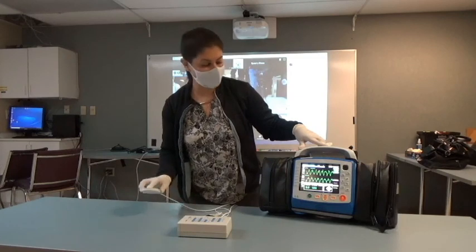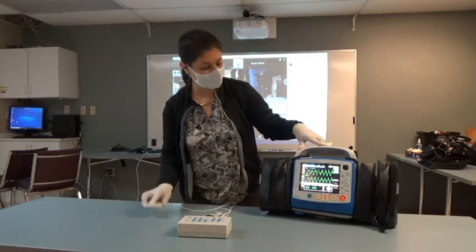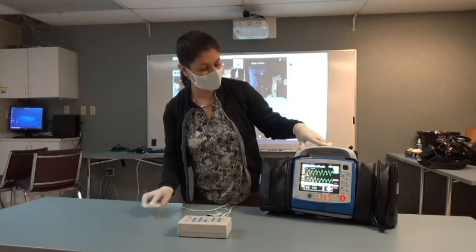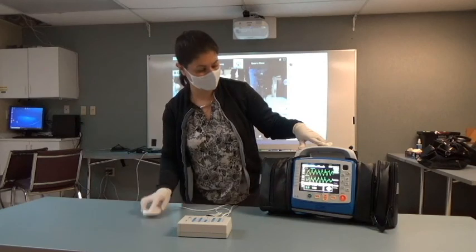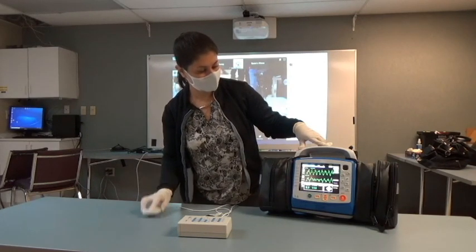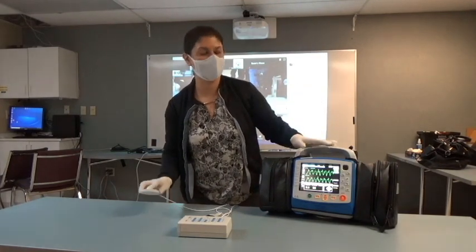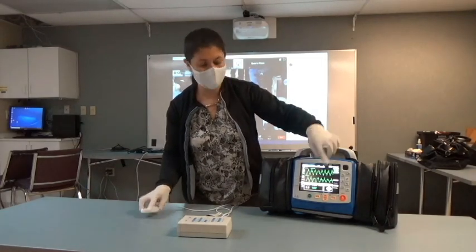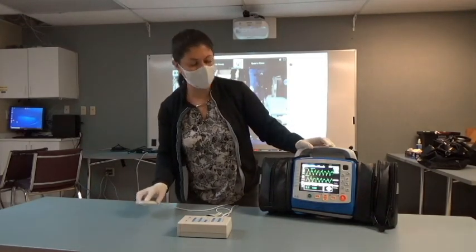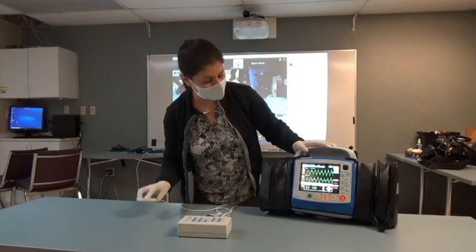I want to treat this like a video game. I want to keep the numbers green and the diamond filled. If the number goes yellow, push harder. I make the correction. Good compressions. Those are features that just help with your CPR compression. The number goes yellow, it can give you an audible feedback as well. You're going to hear the metronome kick on only when I'm not at the right rate.